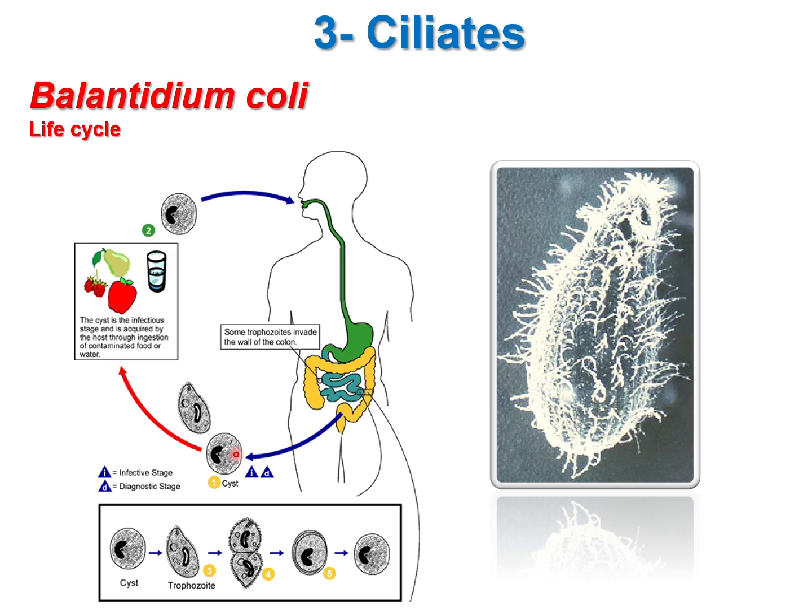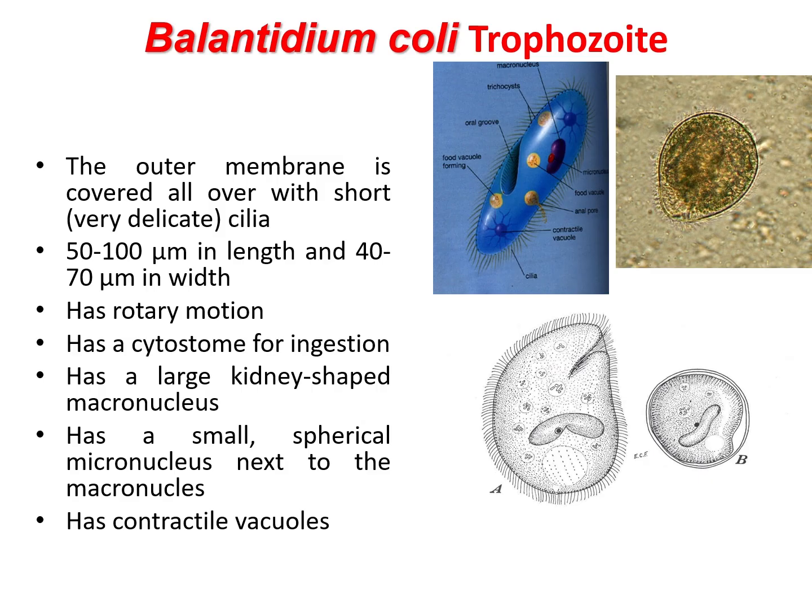Within the stool, we will have the two forms, the cyst, which is the more resistant, and the main transmission form of the parasite. And we can see in freshly isolated stool the trophozoites that are very characterized by the cilia that surround. So if we go over the properties of the trophozoites, I want to explain first on the schematic representation.